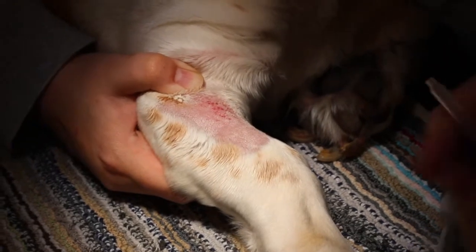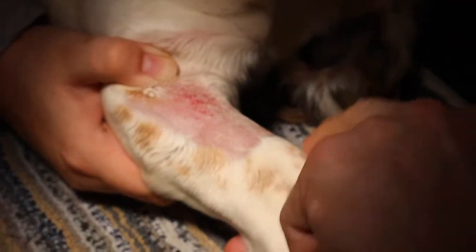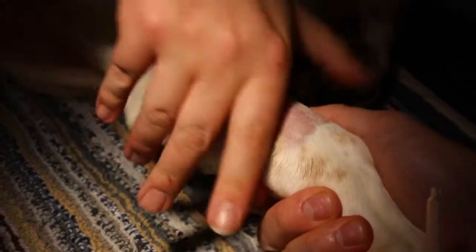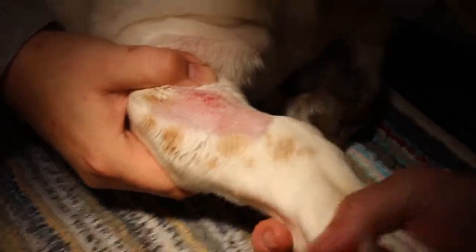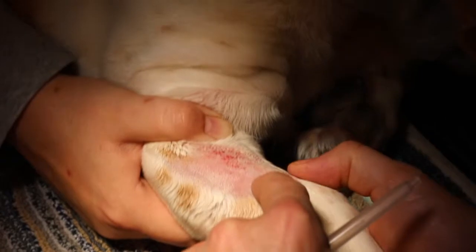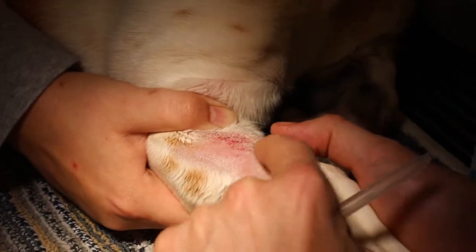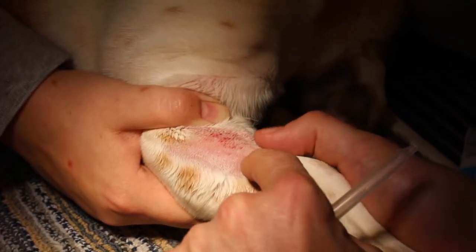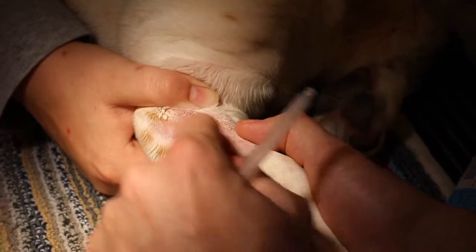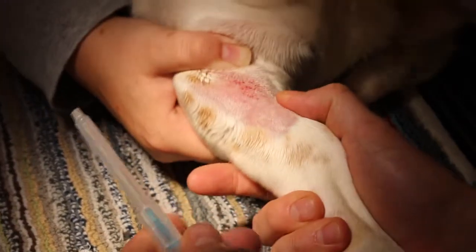So this one is a basset hound. She's got a little curly vein — it's easy to see on the edge right here as it curls around. You can feel all of it. If we squeeze the foot and pump it back up a little bit, then you can find it here and follow it on up. It bulges to the left or to the right when I touch it. So what I'm going to do is hold that vein that's curling this way with my thumb so it doesn't go anywhere and I have something to press against.